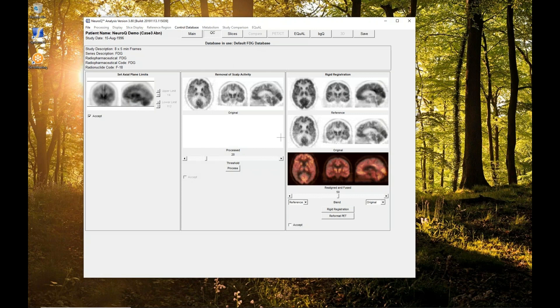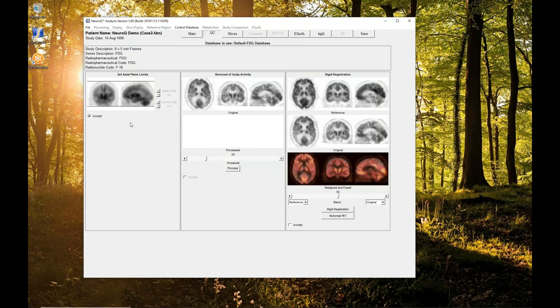That's the normal file selection. There are three panes for the FDG analysis. One is to set the axial limits. You don't want them real tight. We did this because we had at least one manufacturer who, instead of just scanning the brain, scanned all the way down to mid-sternum. With that much information, the template registration tends to not work as well. That's why we added this axial plane limits, just to limit it to where the brain is so that it will match and register with the template a little better.